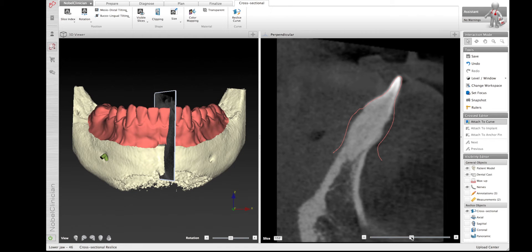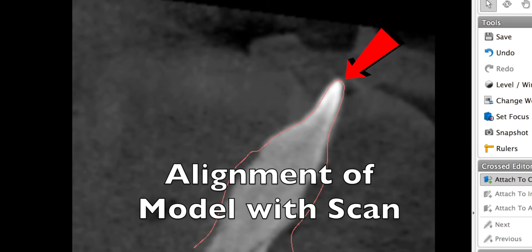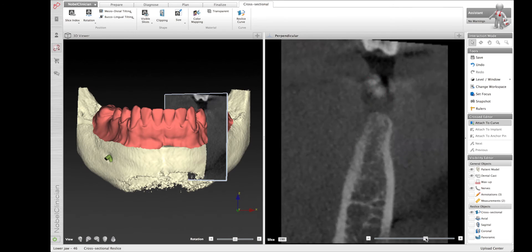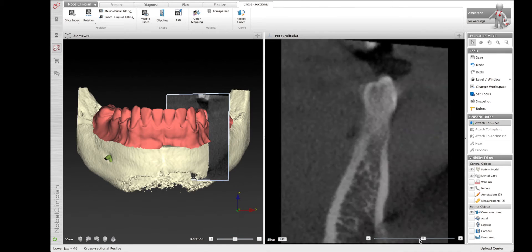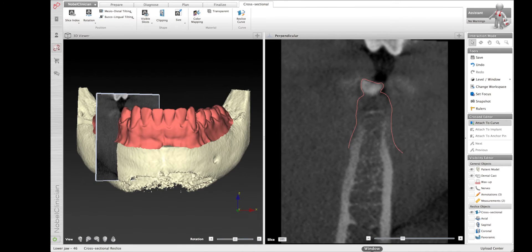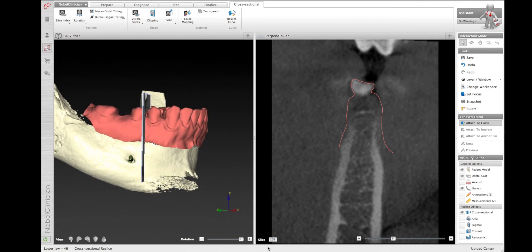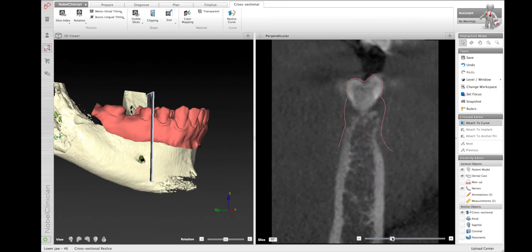After leveling the model in the CT it's important to make sure that the alignment is okay. We'll check this in three different positions — anterior and posterior — to make sure that the pink line lines up with the teeth themselves. This ensures that when you're doing your planning, the bone is going to be referenced to the actual model that's been smart fused into the CT scan.